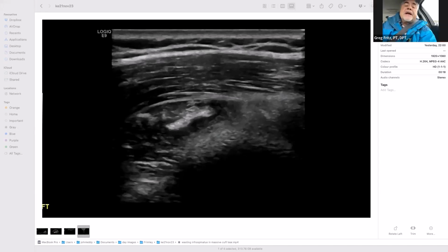How much supraspinatus imaging do you do of the muscle belly, and are your eyes looking at the actual meat, or are you looking at, say, when you scanned the short axis infraspinatus, you could see the glenoid and that kind of stuff? How much labrum assessment are your eyes doing, or any of the neurovascular bundles, that kind of thing?